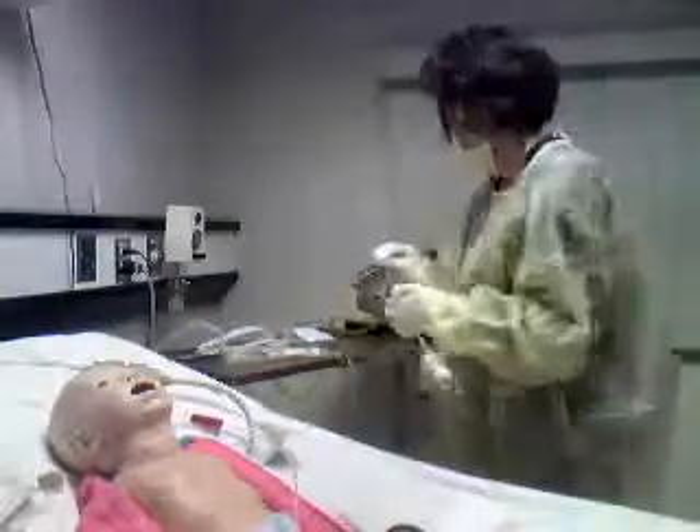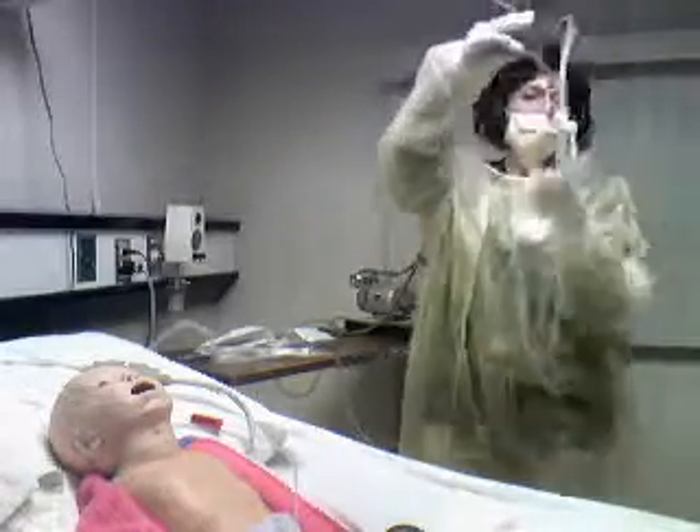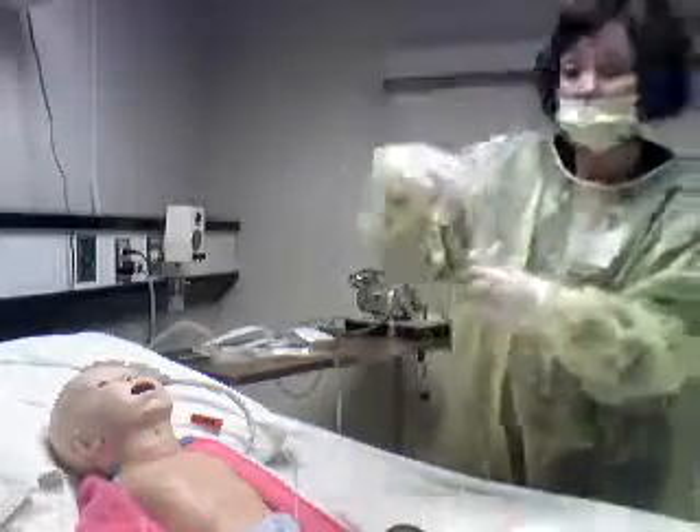Okay, and then console the child. You can see that we have specimen in here, and then you're done. Thank you.